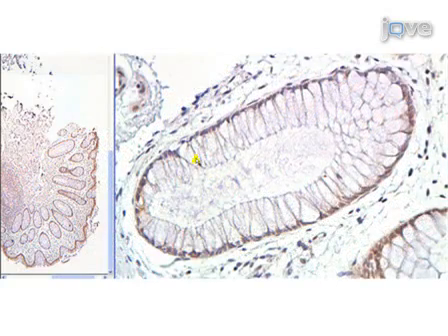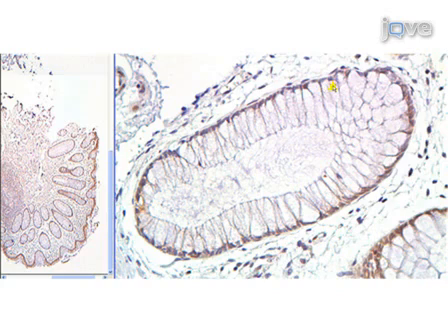Here is the first crypt we will be scoring. As you can see, the nuclei along this edge are almost completely deficient. On the other edge, there is a small amount of expression, and we label this crypt level 1 for very low staining and dot it orange.